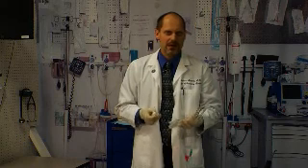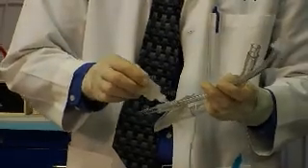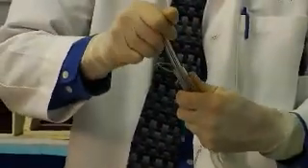Intubation through a supraglottic device is an important technique to learn to master and is very important for airway management. The first step when intubating through a supraglottic device is to make sure that your endotracheal tube is adequately lubricated to pass through the supraglottic device. Generously lubricate your endotracheal tube and pass it through your supraglottic device several times until it passes very easily.